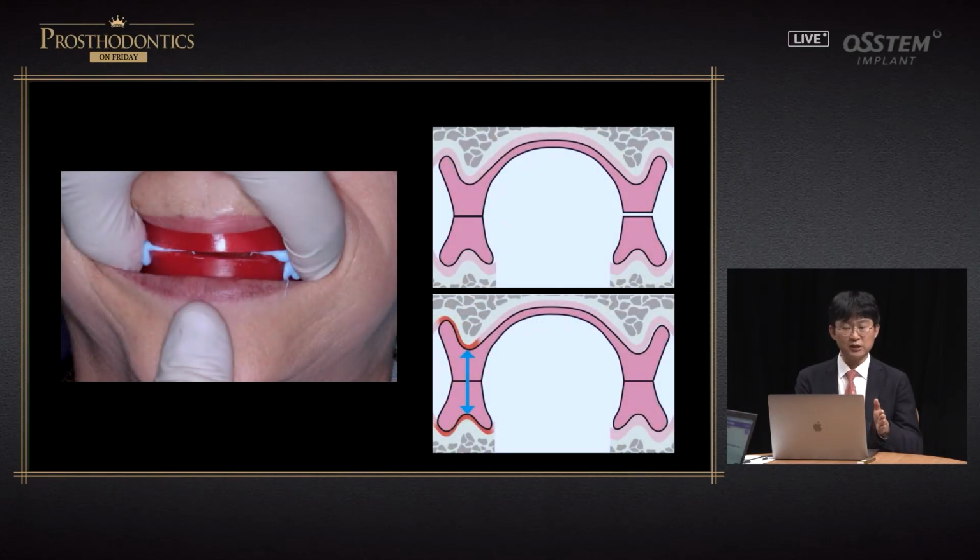If we obtain occlusion from wax rim, you would adjust the wax rim to make it uniform on the chair side and take bites with silicone. The technique can easily result in occlusal errors. The wax rims may look evenly in contact in occlusion, however, they may not be all in contact due to a deformed base caused by the distortion in mucosa. So even contact of wax rim is hard to achieve. So it is important to obtain occlusion when wax rims are not actually in contact.